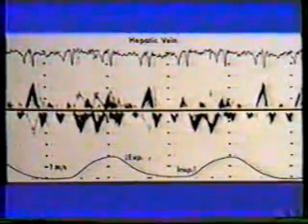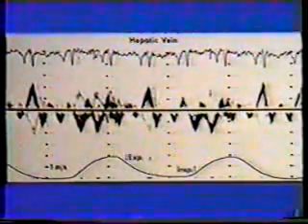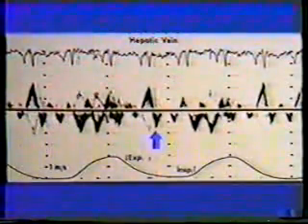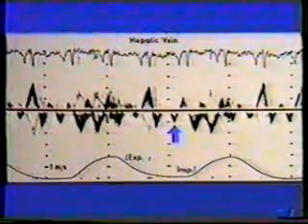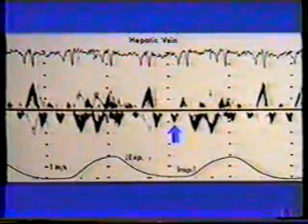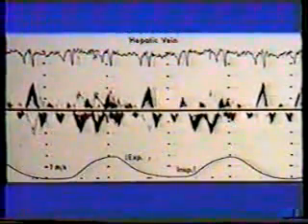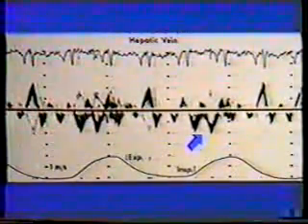This patient's hepatic vein profile was also typical for constriction. During end-expiratory apnea, the profile is normal, with systolic forward flow velocity slightly exceeding diastolic forward velocity. And there is a small atrial flow reversal. With inspiration, both forward velocities increase.